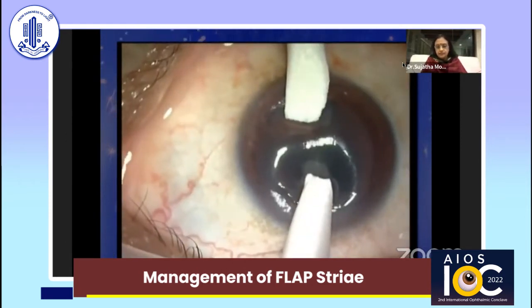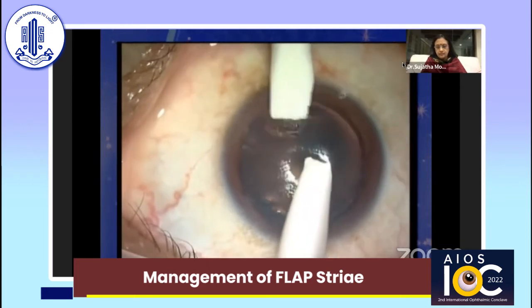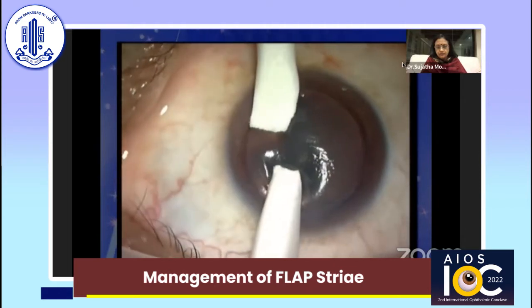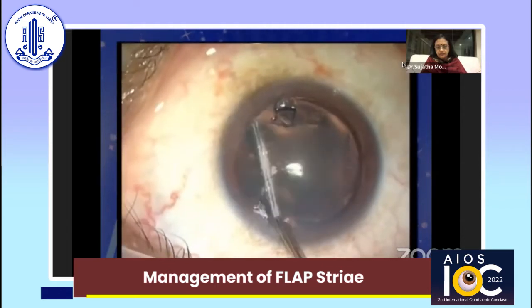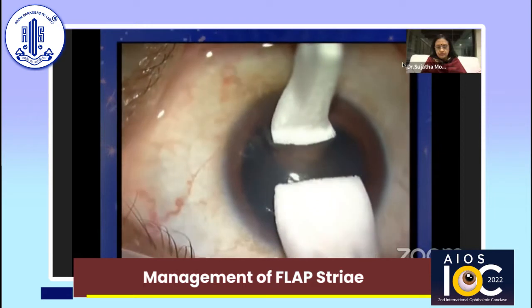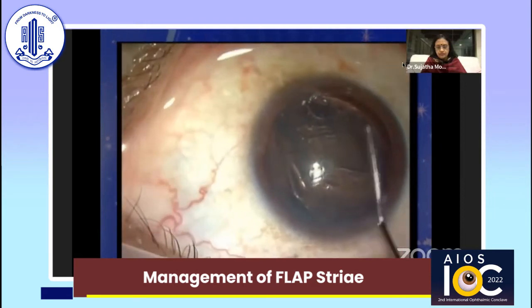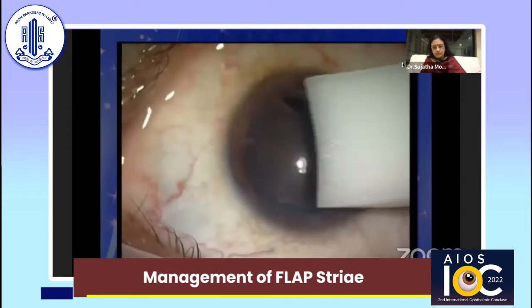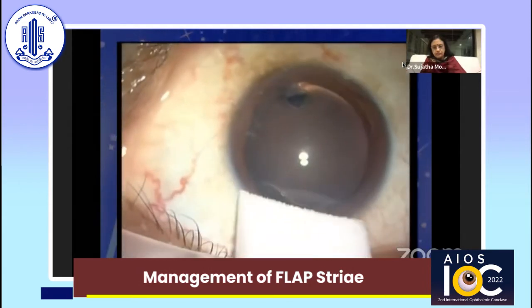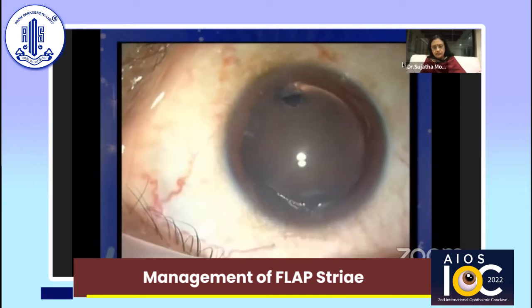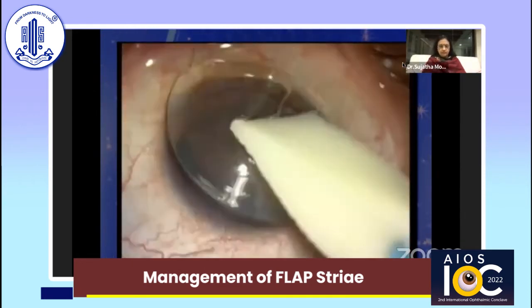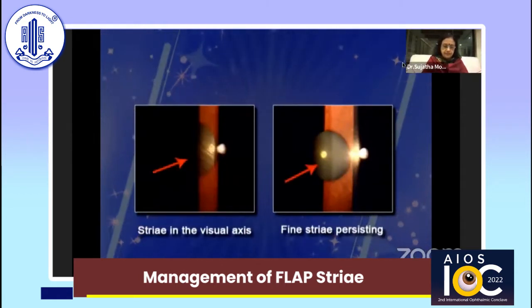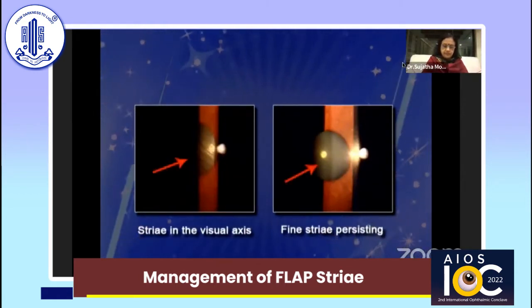Two dry Merocel sponges are used to stretch the striae perpendicular to its direction. The stretching is done repeatedly till the visual axis is clear. The flap is replaced meticulously and a bandage contact lens is applied. The post-operative photo shows clearing of the macrostriae with significant visual improvement.